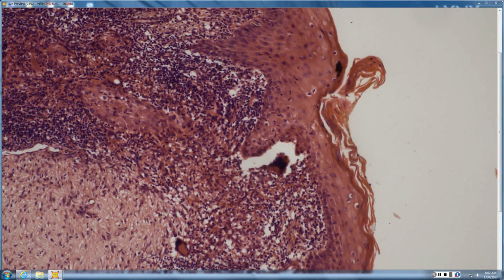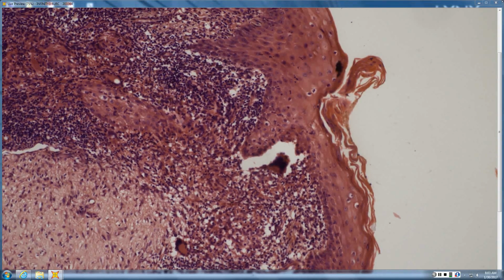Spirochete? So spirochete, absolutely. You would have to consider syphilis in this. So gummatous syphilis, absolutely. So you get a spirochete stain. That can be dicey. It may be negative in gummatous syphilis because the number of organisms is very few. So you need a high index of suspicion for gummatous syphilis.